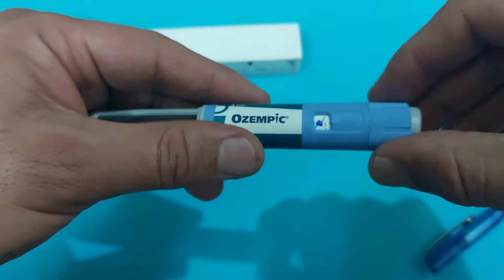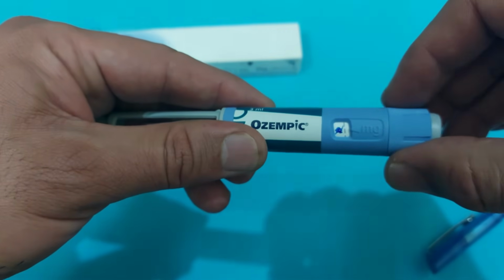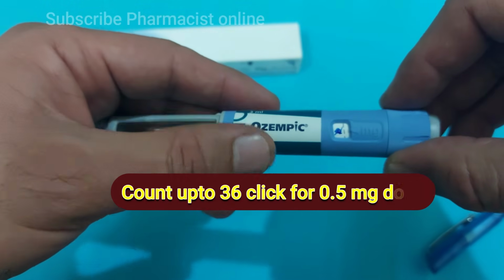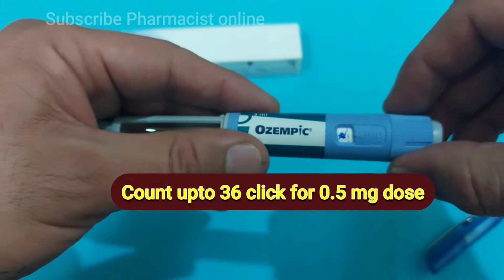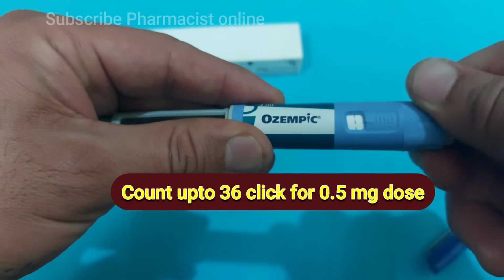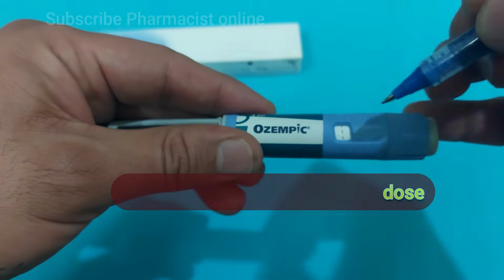The same way, you go further and count until 36. So you count 18 more, and you will get the 0.5 milligram dose from this 1 milligram pen. Come here until 36. For example, this is our 36, so we will mark this point.